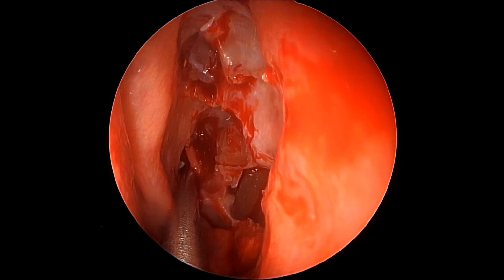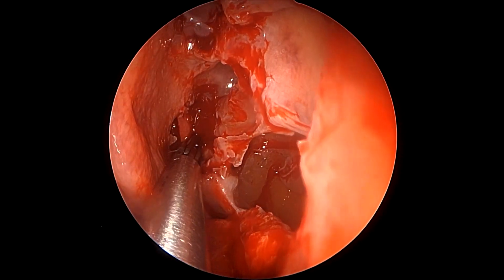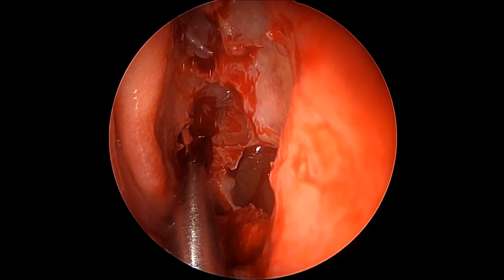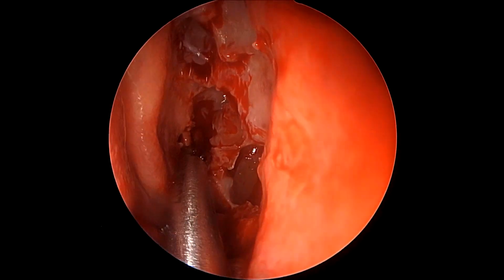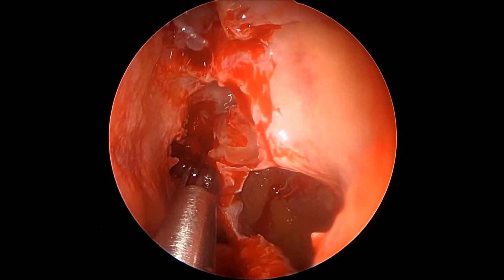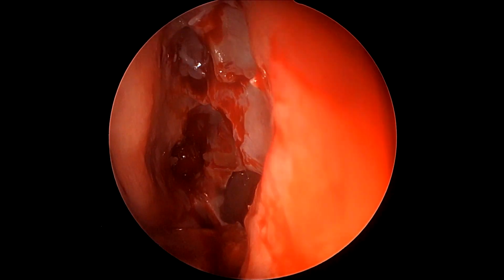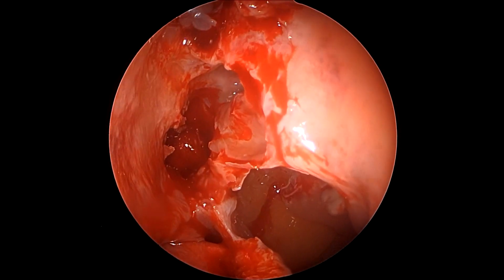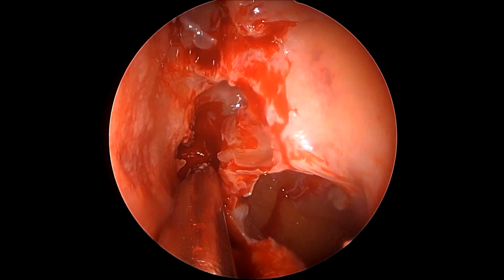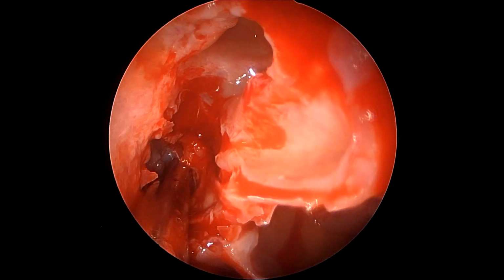Once our navigator probe correctly points our trajectory straight towards the sphenoid sinus, we take the fine straight cutting through-cut and bite off the inferior half or so of the superior turbinate to widen our access towards the sphenoid sinus. And as we see, our dissection still is at the level of the horizontal antrostomy ridge, which is also the medial orbital floor, because that is the approximate level of the sphenoid ostium.